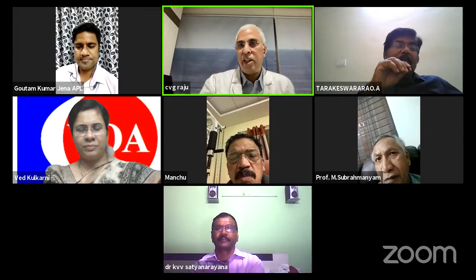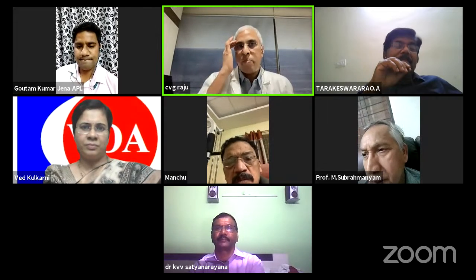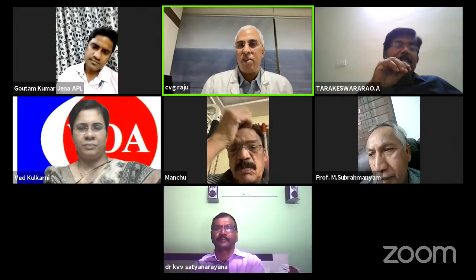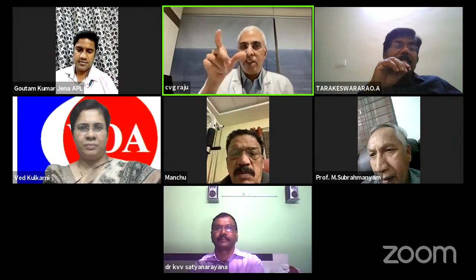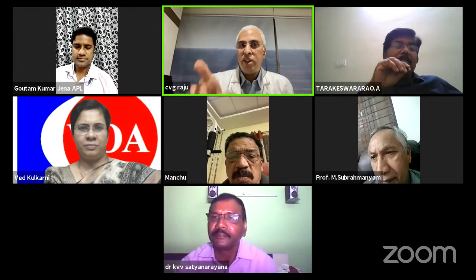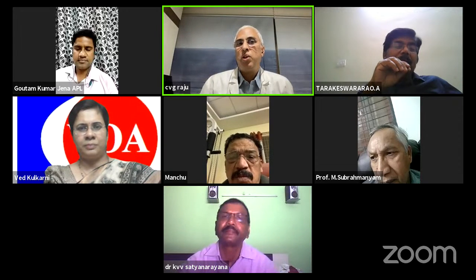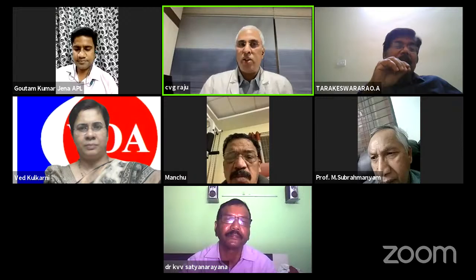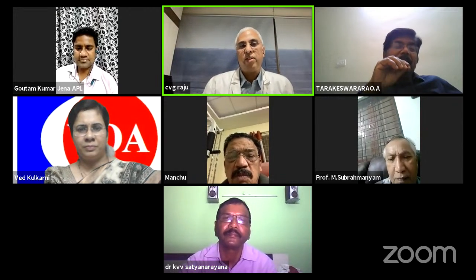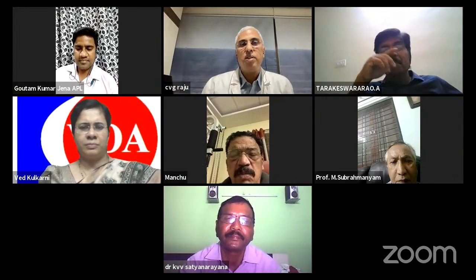Like in the typical case which I have shown you, in this left eye there is a notch and an inferior RNFL wedge defect. But if you see the GCC when compared with the right eye, there's not much. It's very early, minimal damage. Okay, so they're not at 30% damage at that stage. Thank you.